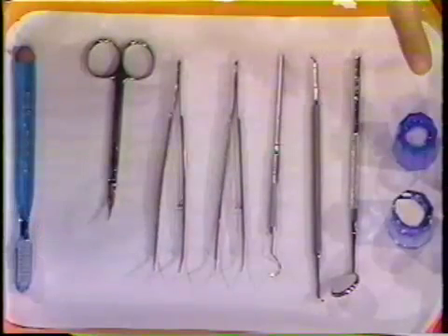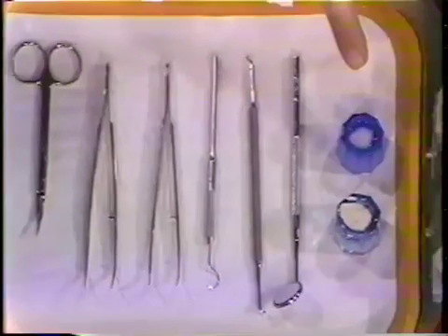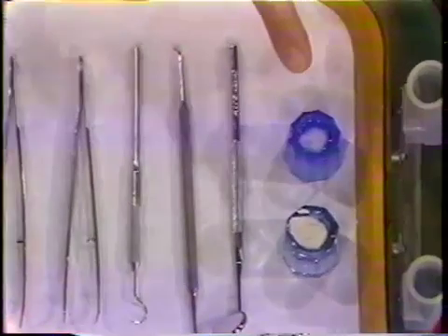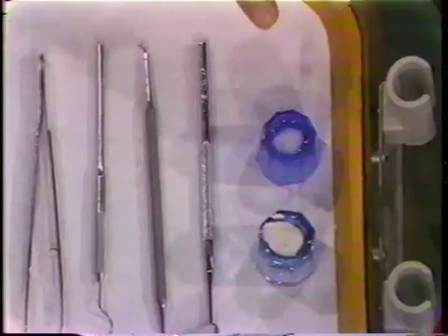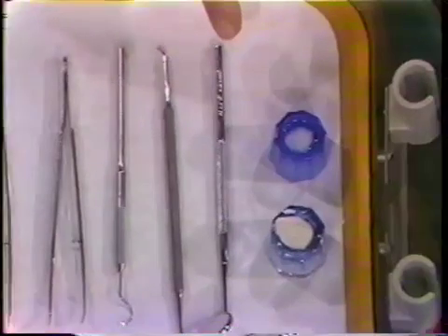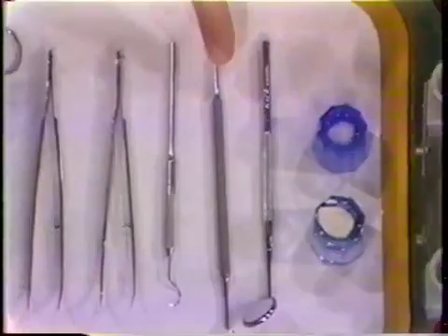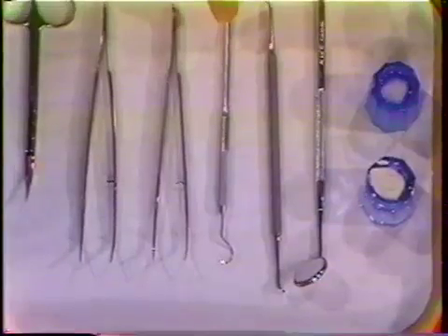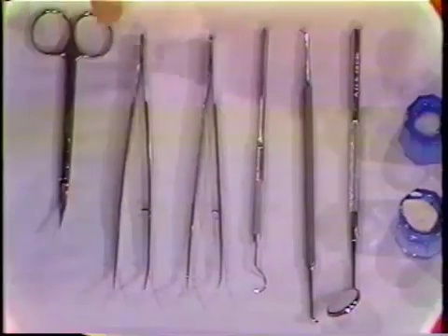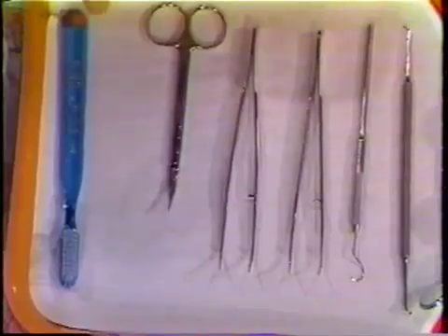On the left side of the bracket table are two dampened dishes. One has 4% liquid xylocaine, the other has pumice with 2% fluoride used as the liquid. Next is a mouth mirror, a Wesco No. 1 scaler — it's like a modified hoe that is very rigid — a sickle explorer, two cotton pliers, suture shears for removing sutures, and a toothbrush for oral hygiene instructions after the dressing has been removed.